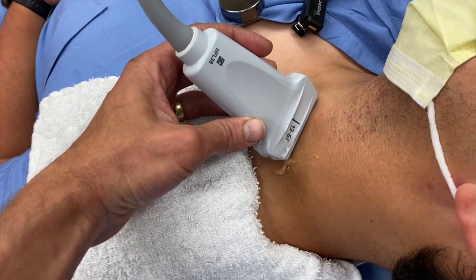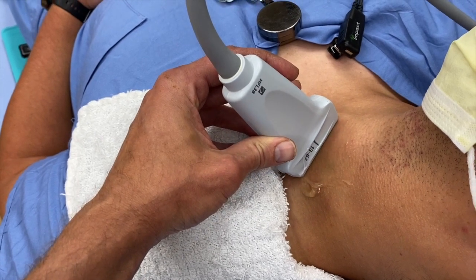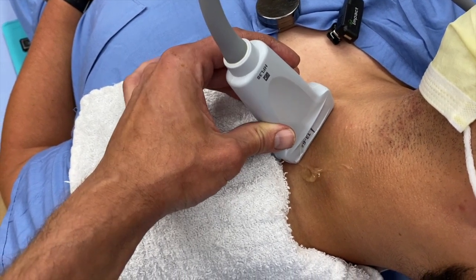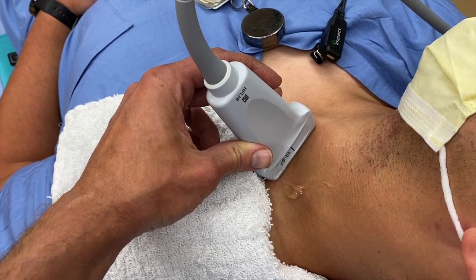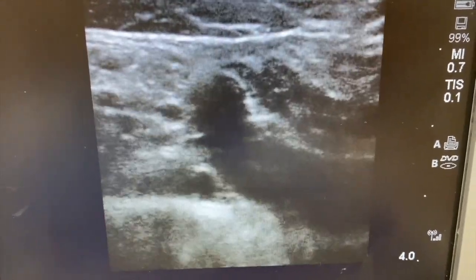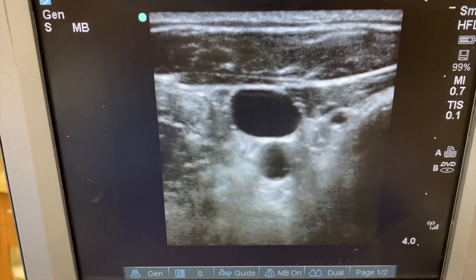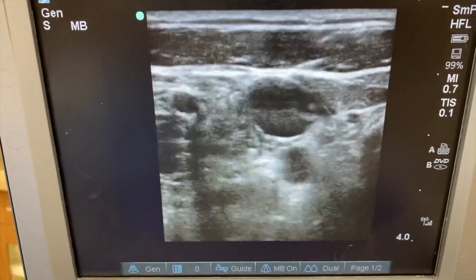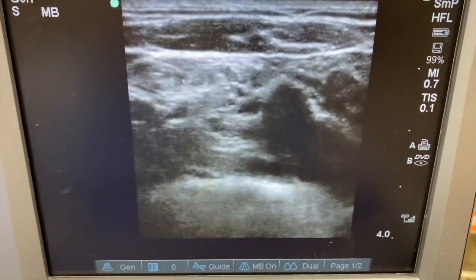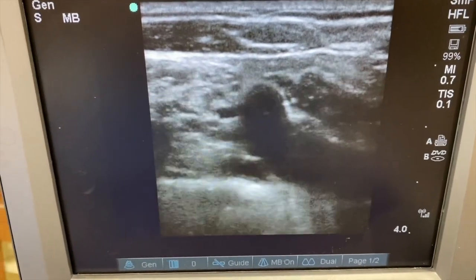This is what the position looks like in real time. As you start to map this, you begin in a typical IJ approach. Then as you move the transducer down and it rests on the top of the clavicle, you rock it back and forth until the subclavian comes into view. Once mapped out, you move over, clean off the area, and start your approach. You'll see the typical IJ view with the vein on top and carotid below, then as you move down you see the subclavian with valves moving as blood flows back and forth — confirming venous access. This is the perfect entry point for the needle.